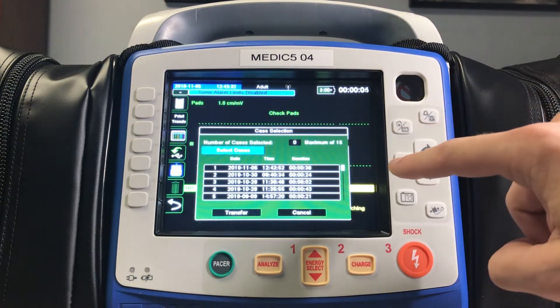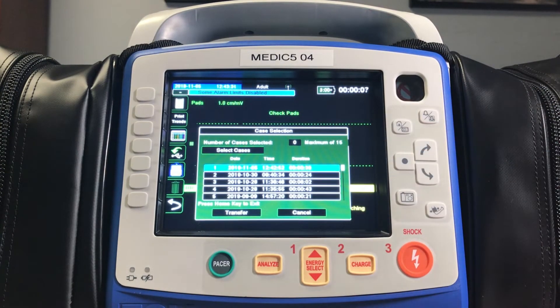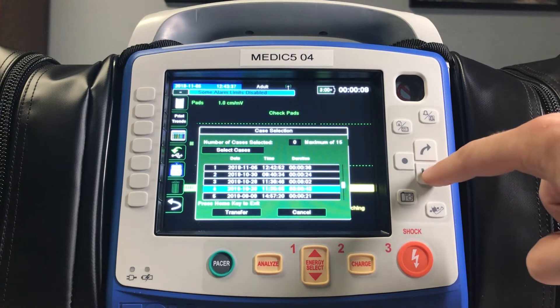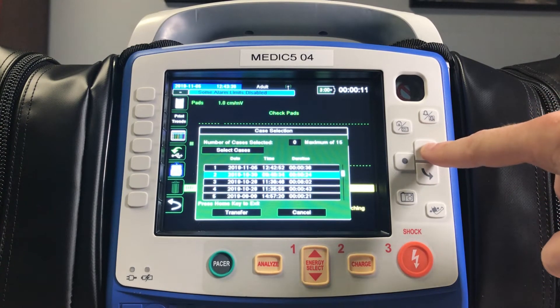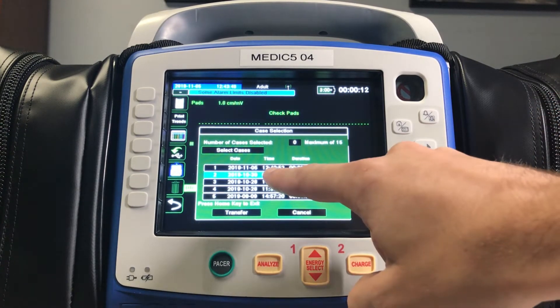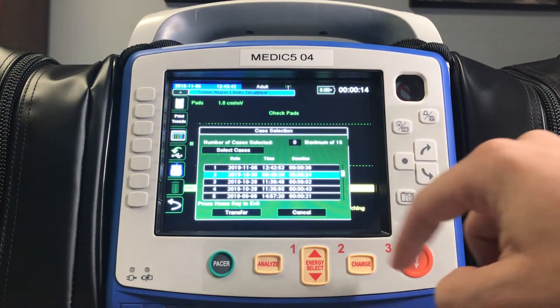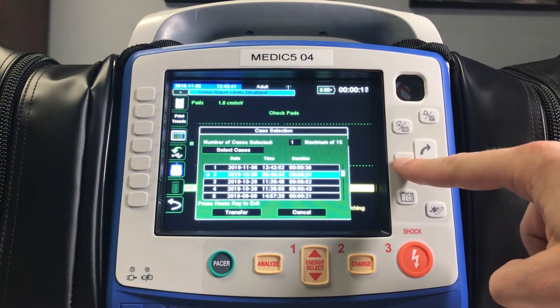You'll then select the select cases option on the screen and move the arrows to the case that's yours. You'll be able to confirm it's yours because it lists the start time the monitor was powered on and the duration of the case.